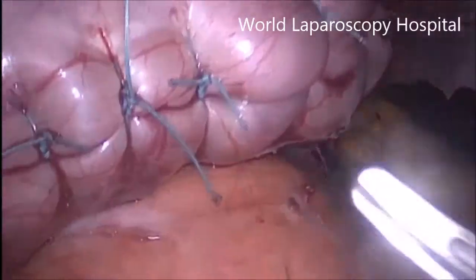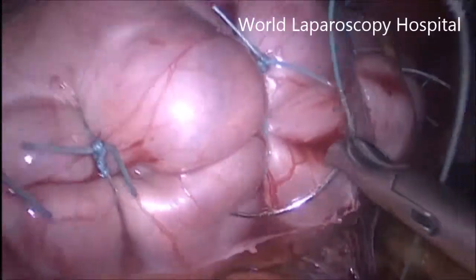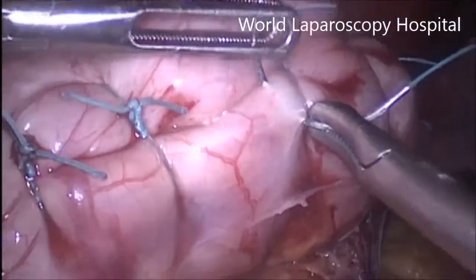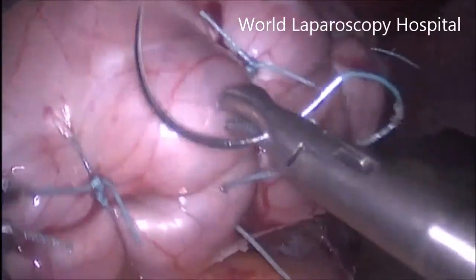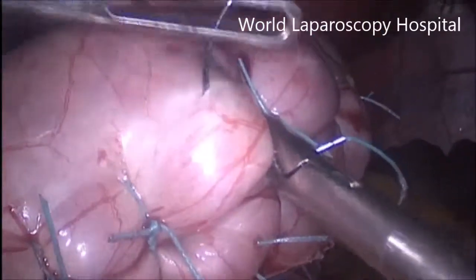So these all are interrupted sutures in between, where you have done the first row of plication, then in between these interrupted sutures are given.